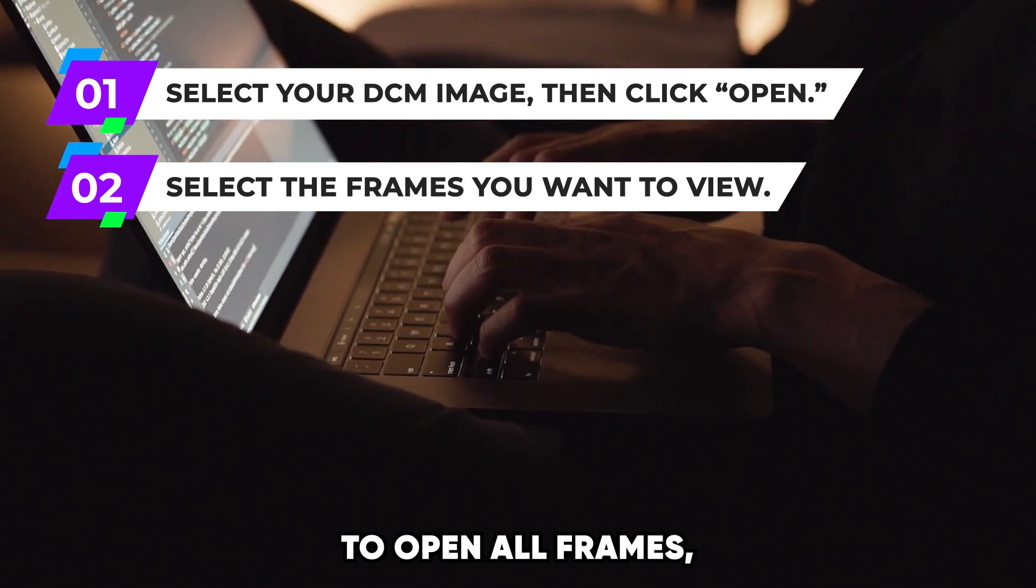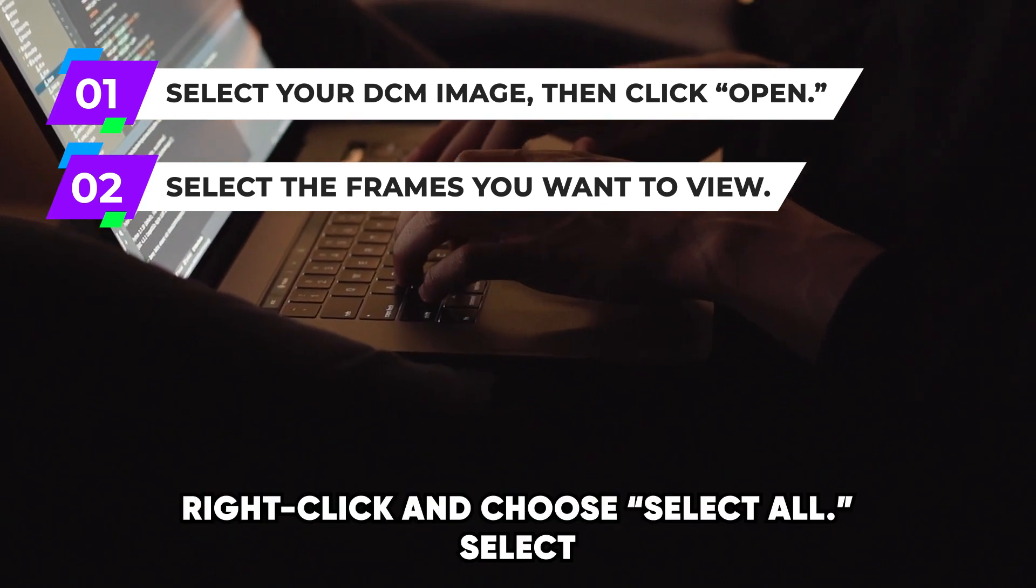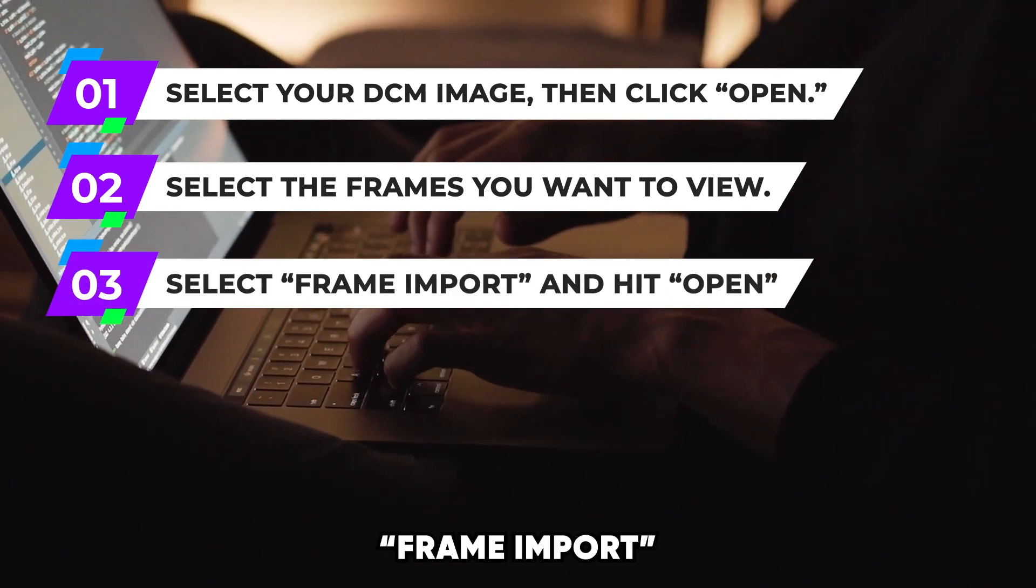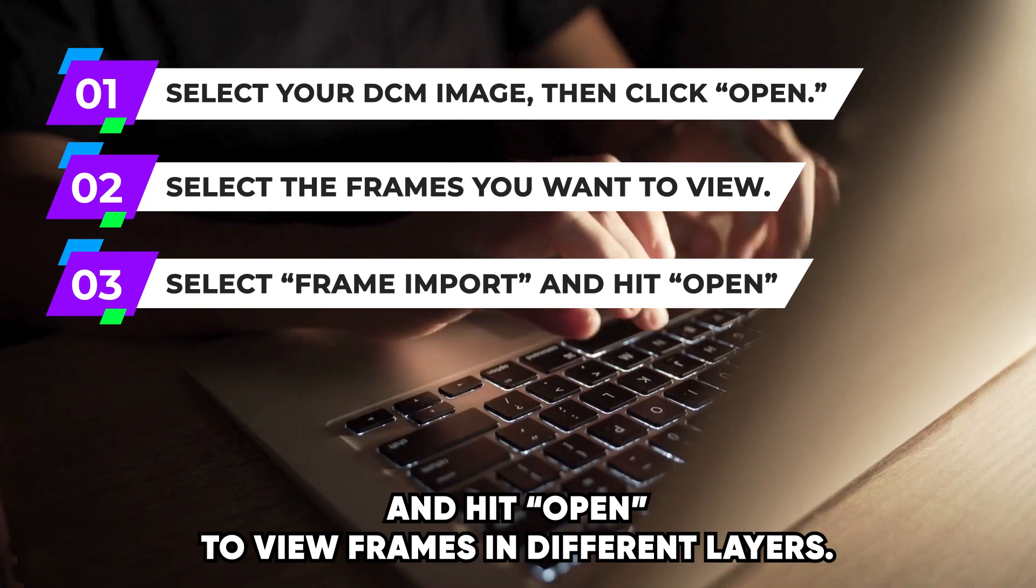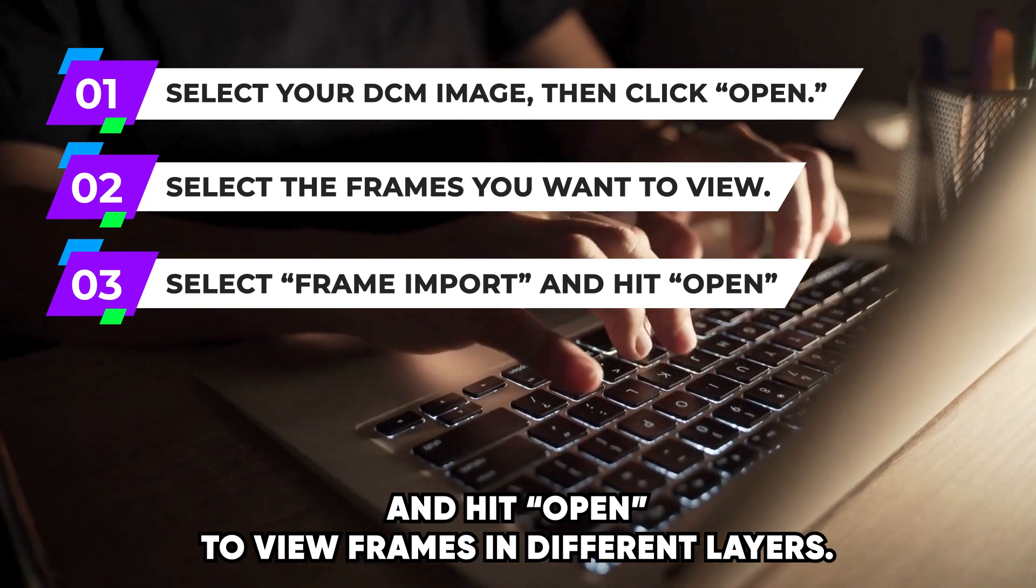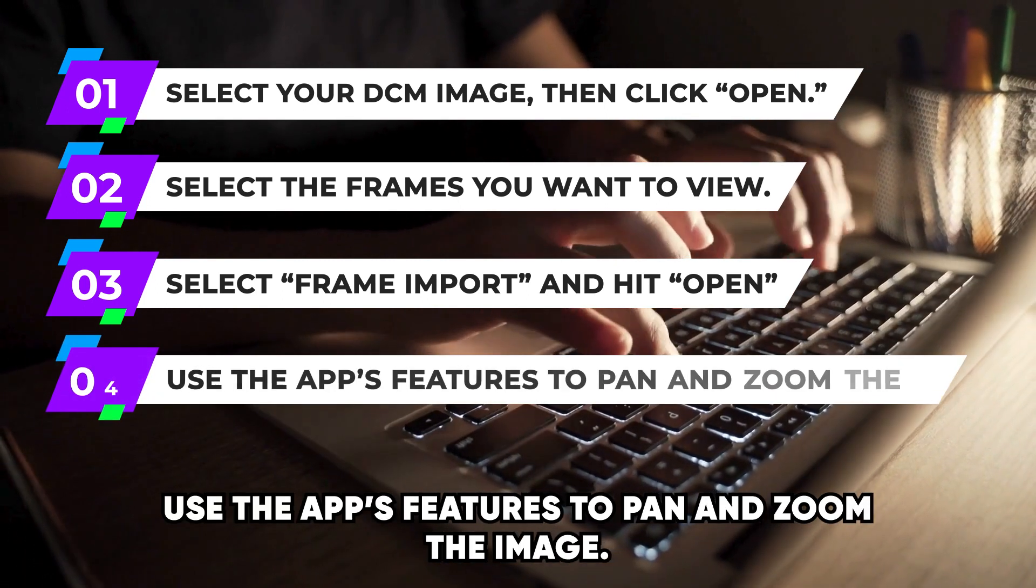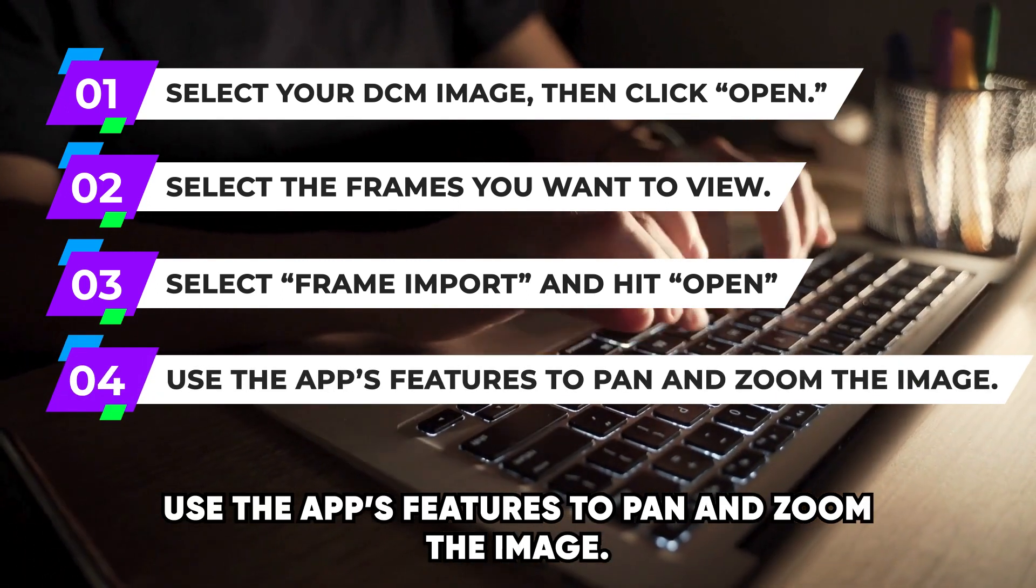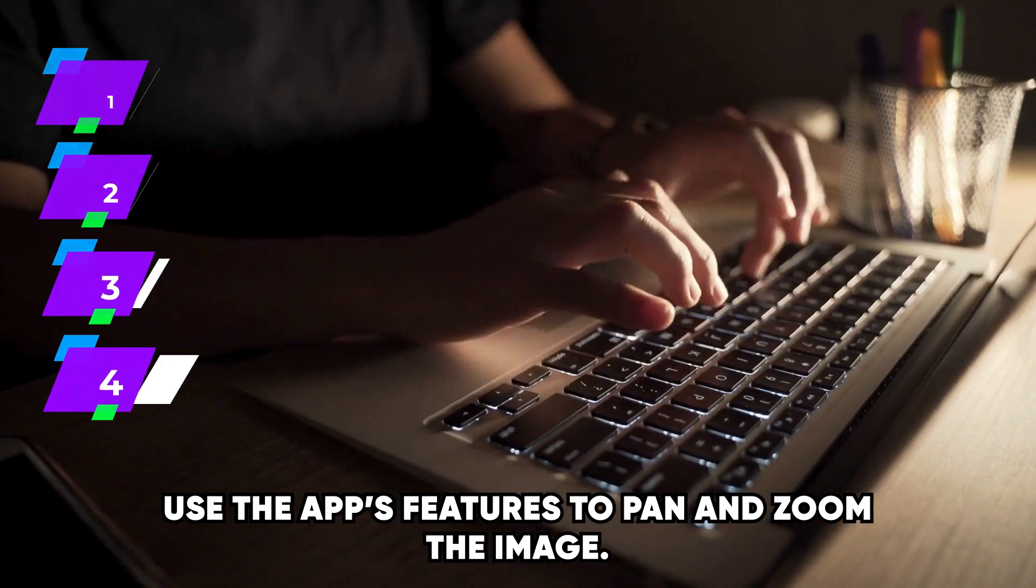To open all frames, right-click and choose Select All. Select Frame Import and hit Open to view frames in different layers. Use the app's features to pan and zoom the image.